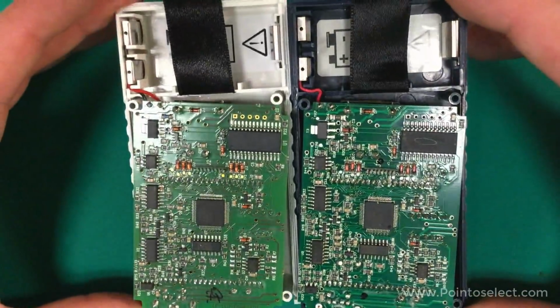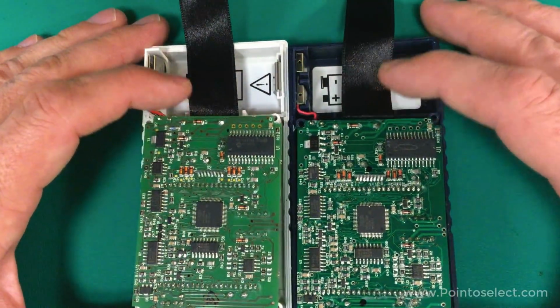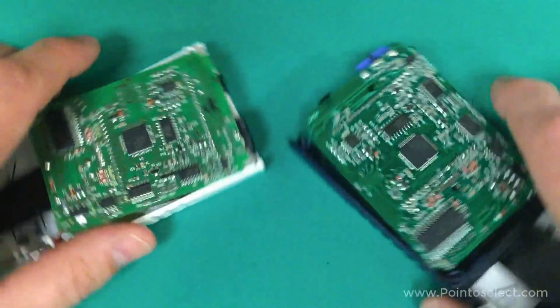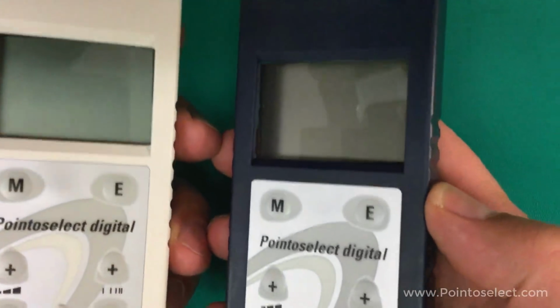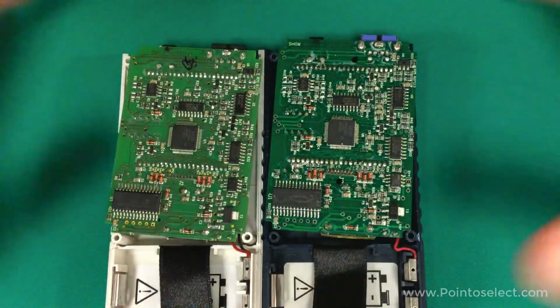Well, having looked over this, it appears to me that the construction, the components, the quality of the design, every bit of it is exactly, precisely the same in every way. And the only thing that would be different is the color.